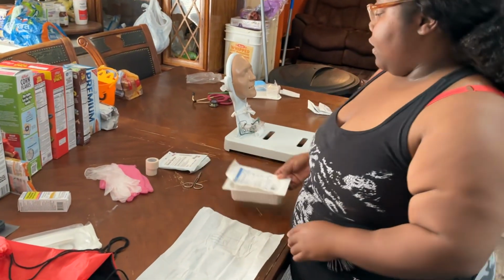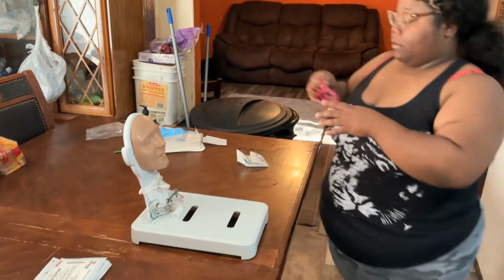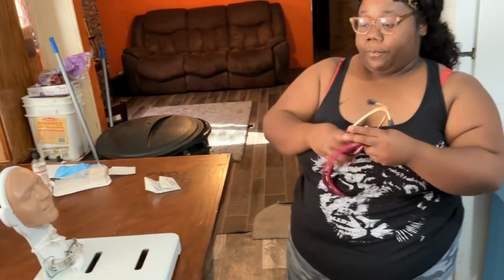Next, I'm going to go in. I want to reassess my patient's lung sounds to make sure we got those secretions cleared. So this is already clean and ready to be used. Let me verbalize this too.